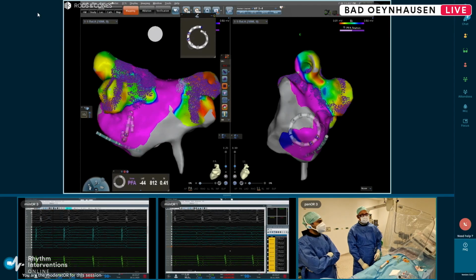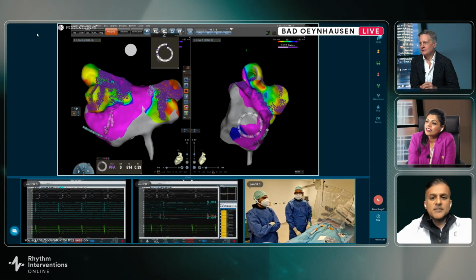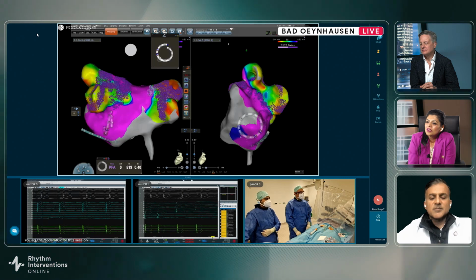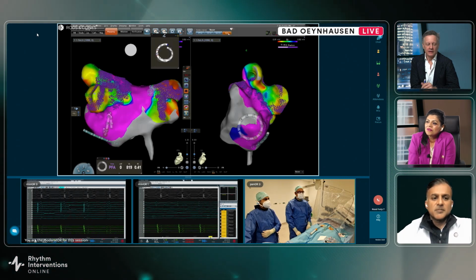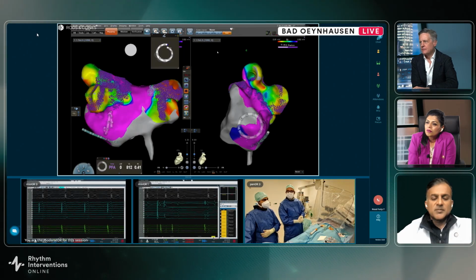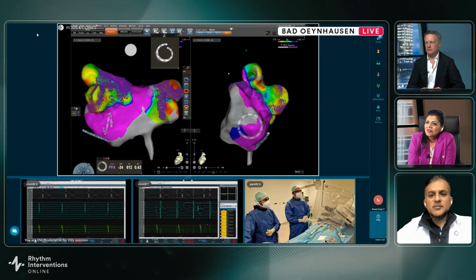It's good to know that we're still better. Do you ever do isoproterenol testing? Sorry. No, we don't do it. So I want to ask anyone else? I mean, we can discuss it. Yeah. I want to ask you and the panel.